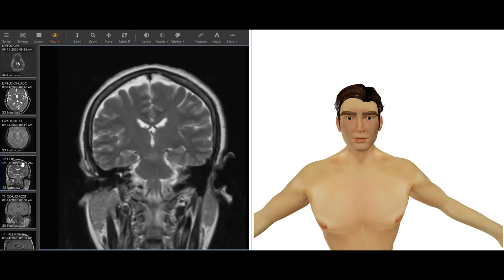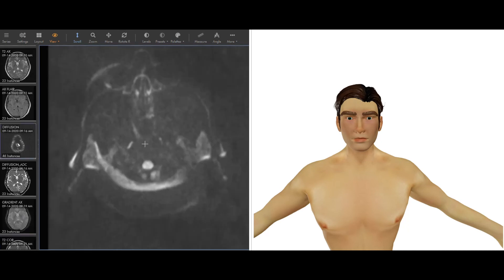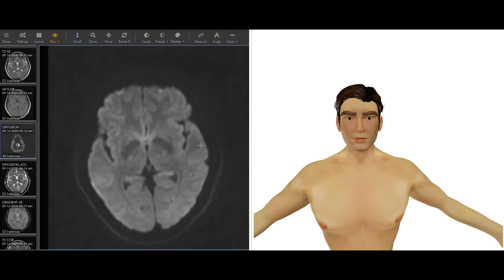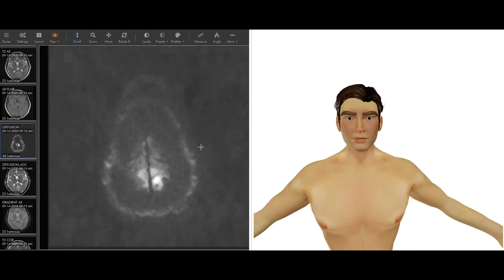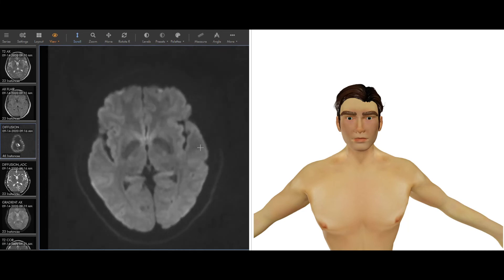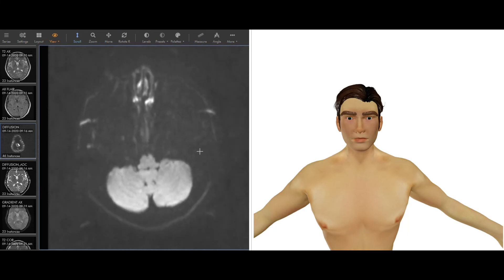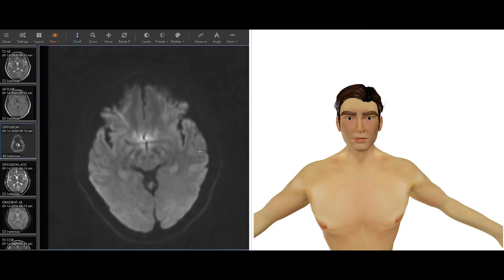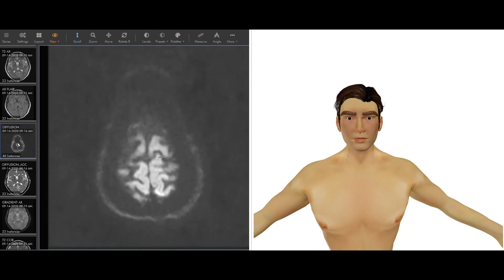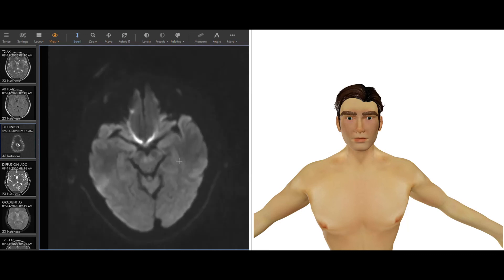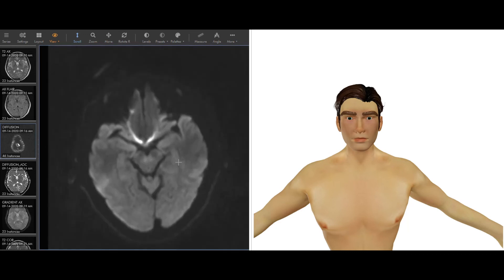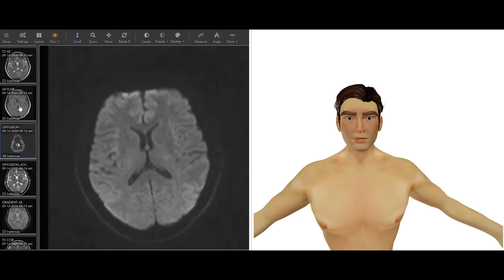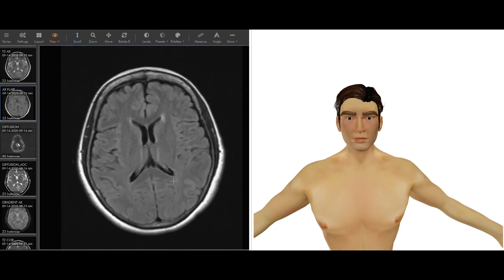Some sequences that are unique to the brain, so the diffusion weighted sequence, this basically is a very quick sequence that is going to show things that are bright that are basically strokes. This is really what this is used for. There's nothing on this one that's bright, but if you have a study that mentions a stroke, it can be bright on here. Other things can be bright, but that's typically what this is used for.